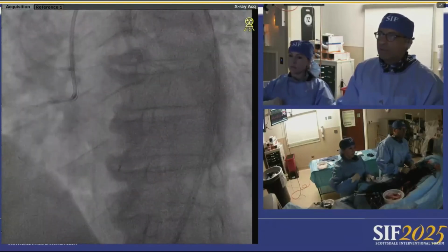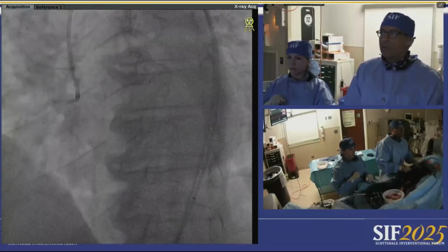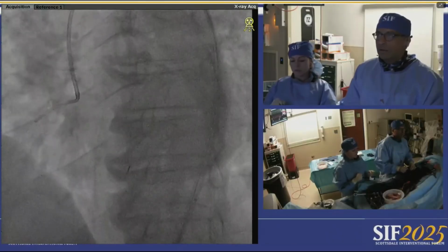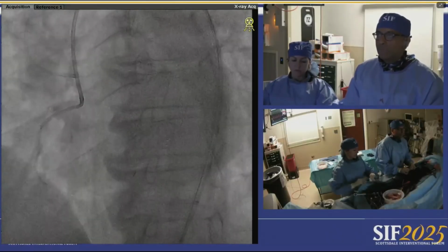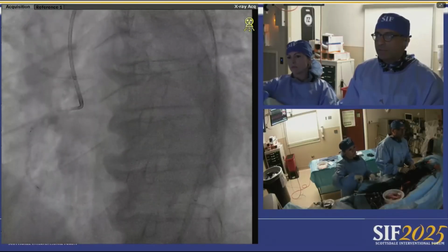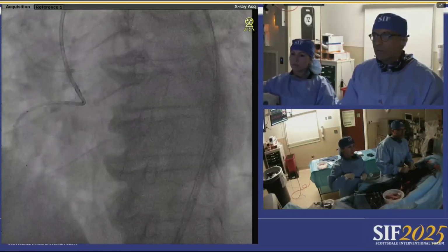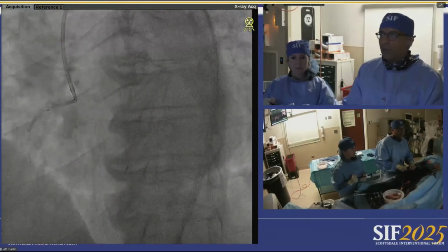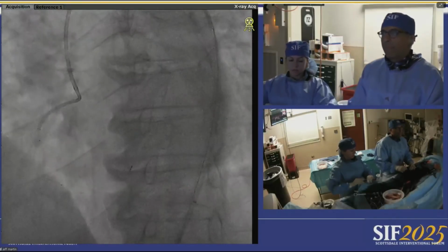Yeah, there was interestingly a lot of eccentric calcium there, and oftentimes we don't have to worry about it. But I will say there were some areas where the eccentricity really had some luminal encroachment that makes you pretty worried about stent expansion. Again, it wasn't a linear pullback, but it looked like in that proximal vessel, where your IVUS wouldn't go, there was a big old knob of eccentric calcium pushing in, so it gives me some concern that NC balloons may not be the ultimate solution there.